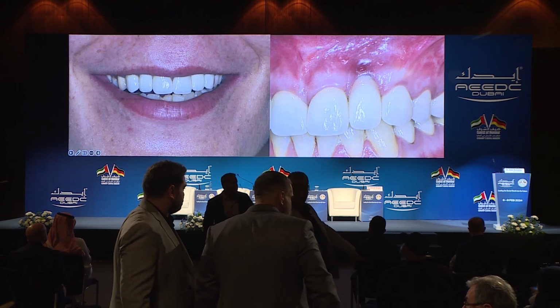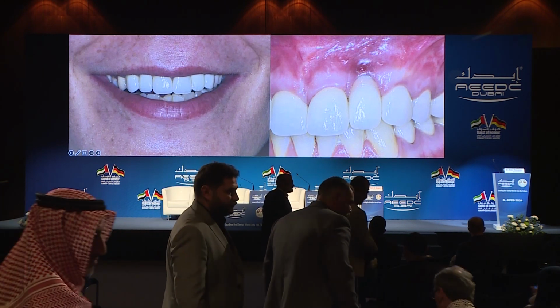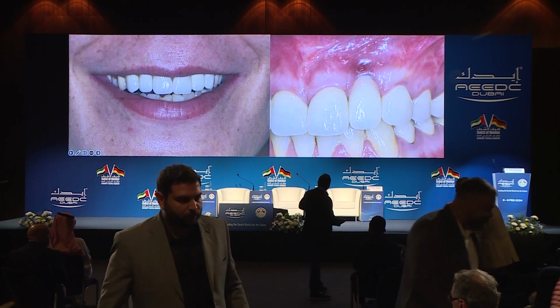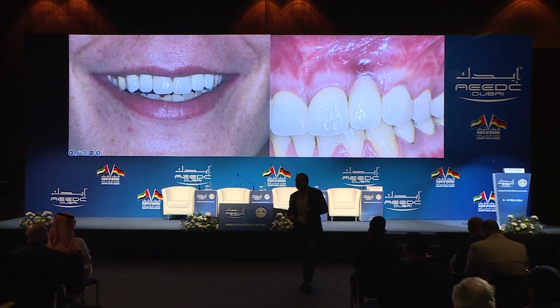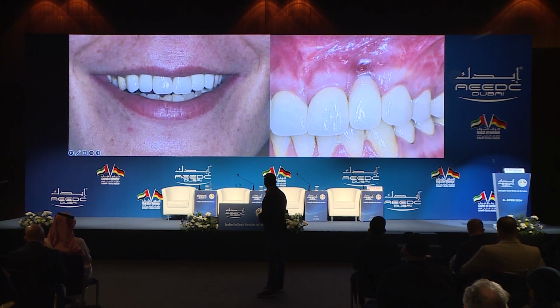This is a surgeon, a friend of mine, an oral surgeon that I work with. He usually places implants in the posterior zone and he referred me out the aesthetic zone. That case, I was out of town, so he had to place the implant himself. And then he sent me the case after a few years. He said, Alain, I have this patient. She's having pain, pus from this lateral.